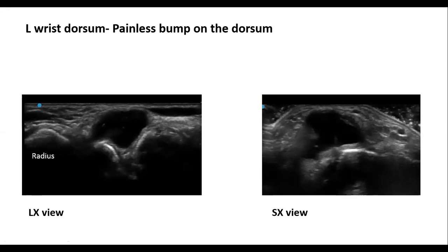Are you saying write the impression from that? Yeah, no, before you write the impression or say the impression, what structure is this? What abnormality? What pathology is this? Ganglion cyst. Okay, good. All right. So just wanted to get that right.